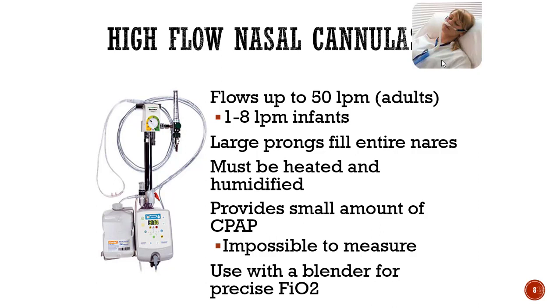It must be heated and humidified. This goes back to, again, that bypassing of the upper airway and why we care about heat and humidity. The other thing that has been a focus of high flow nasal cannulas, particularly with neonates, is that they do provide a small amount of CPAP.